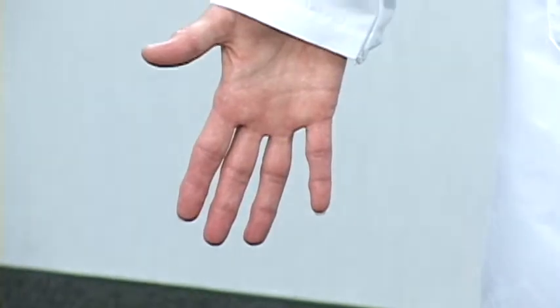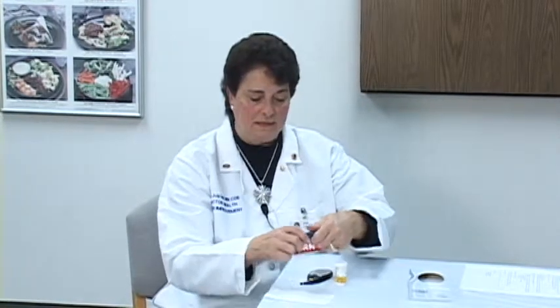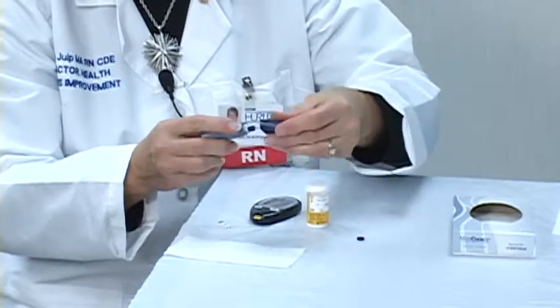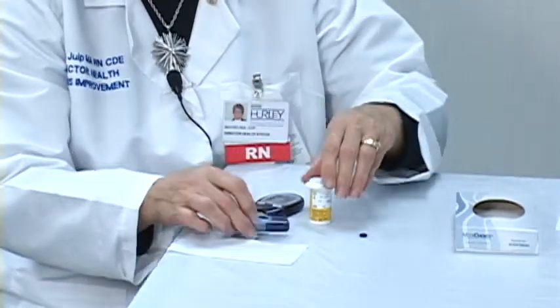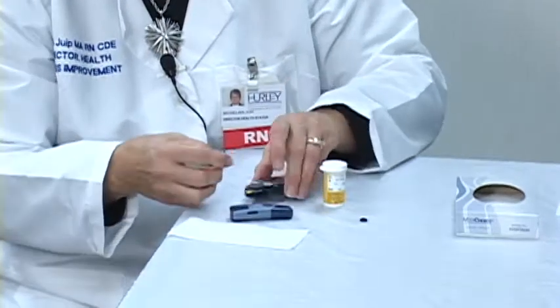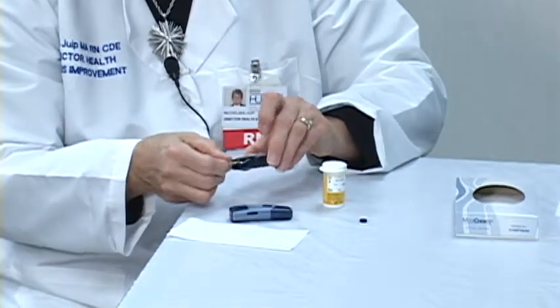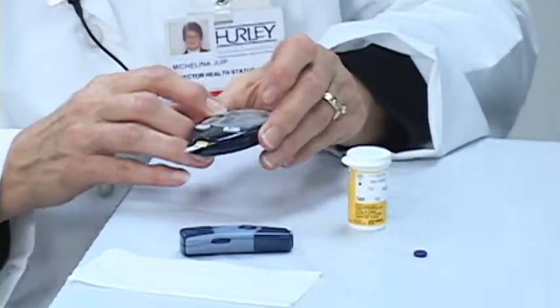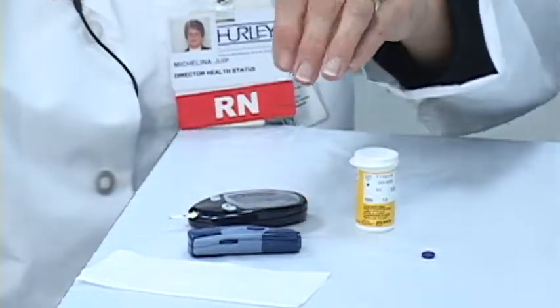If you do these few extra steps, you'll ensure that you'll get a good blood sample the first time you poke. Now I'm going to show you how to do a successful blood sugar test. Having already washed my hands, I'm going to put the lancet into my lancet poking device and adjust the dial to the depth of 2. I've taken a strip out of my vial and I'm putting it into my meter. When I see the blood droplet icon on the top of the screen, I know that the meter is ready to accept my blood.